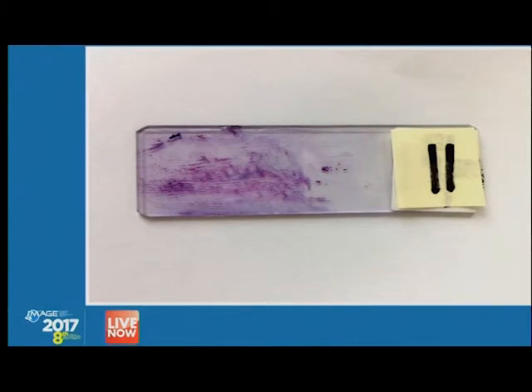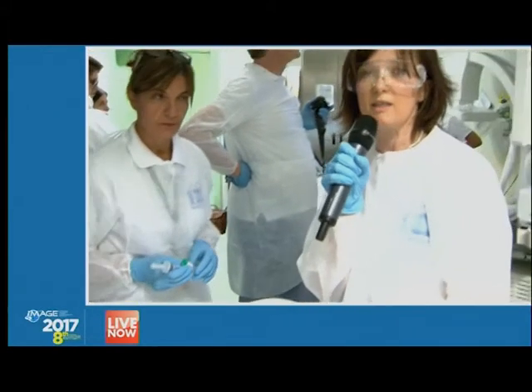I just want to show you the slides of the biopsy that we took yesterday, because we had very good result, not for the patient but for the diagnosis. This is the first slide with staining with hematoxylin and eosin, and you can see the material on the smear. This is what we smear. If you see here how we treated the material, this is just not the specimen that we put into formalin, but is this part. So we prepare 2 slides, and this is the result.